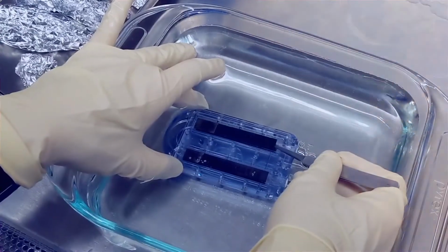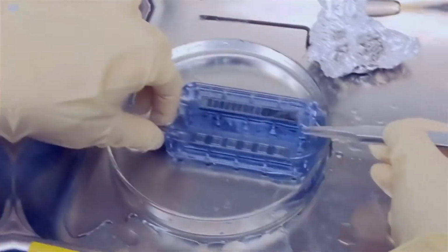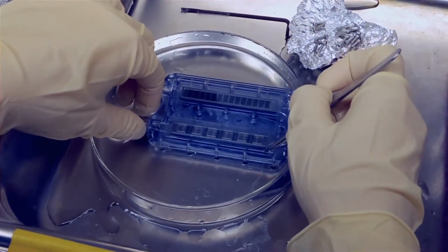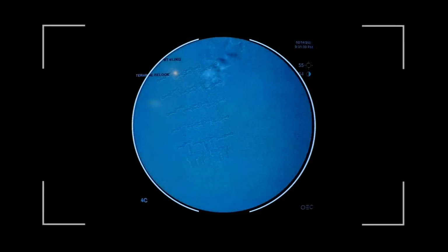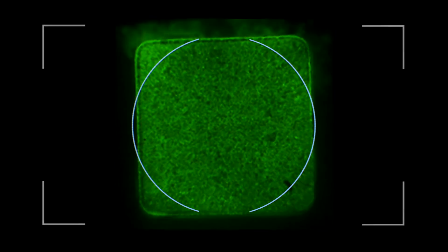The silicon membranes were mounted in polycarbonate housing to construct hemofilters, and in similar fashion, bioreactors were assembled to immunoprotect the renal tubule cells. The hemofilter and bioreactor components were then connected to create bioartificial kidney prototypes for benchtop and preclinical testing. In proof-of-concept experiments, the hemofilter operated under blood pressure alone, without systemic anticoagulation, while the renal cells in the bioreactor remained alive and healthy without immunosuppression.